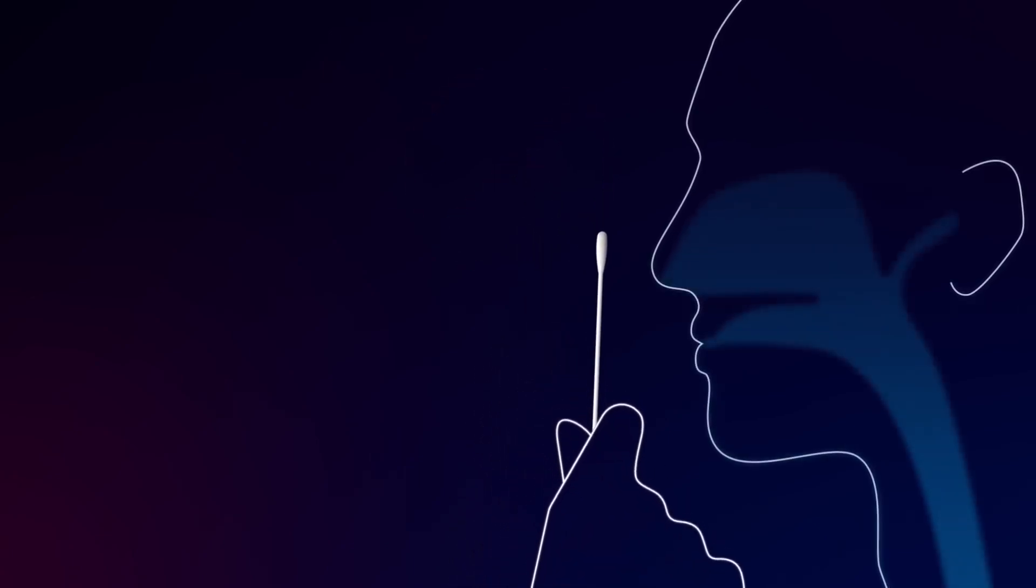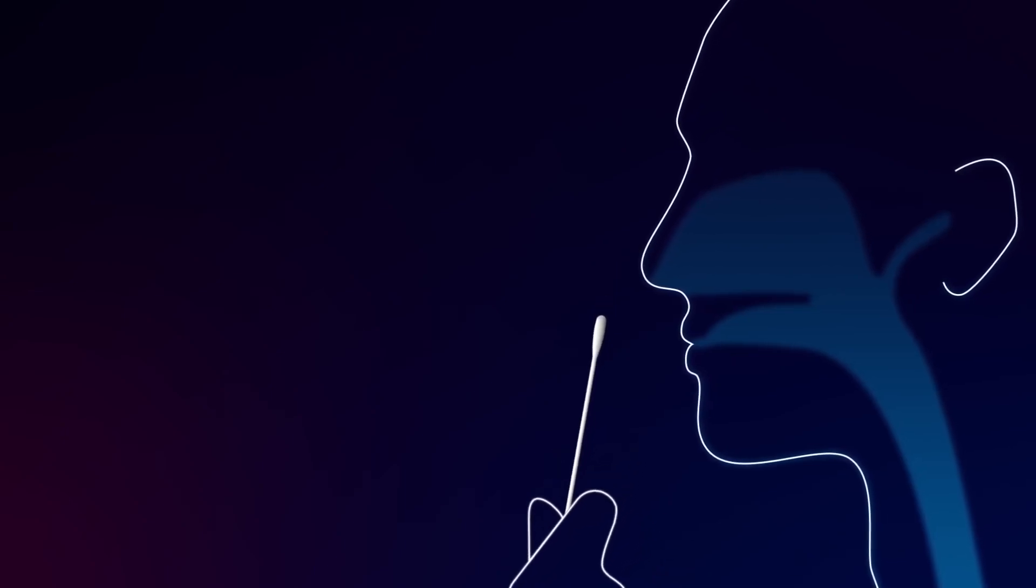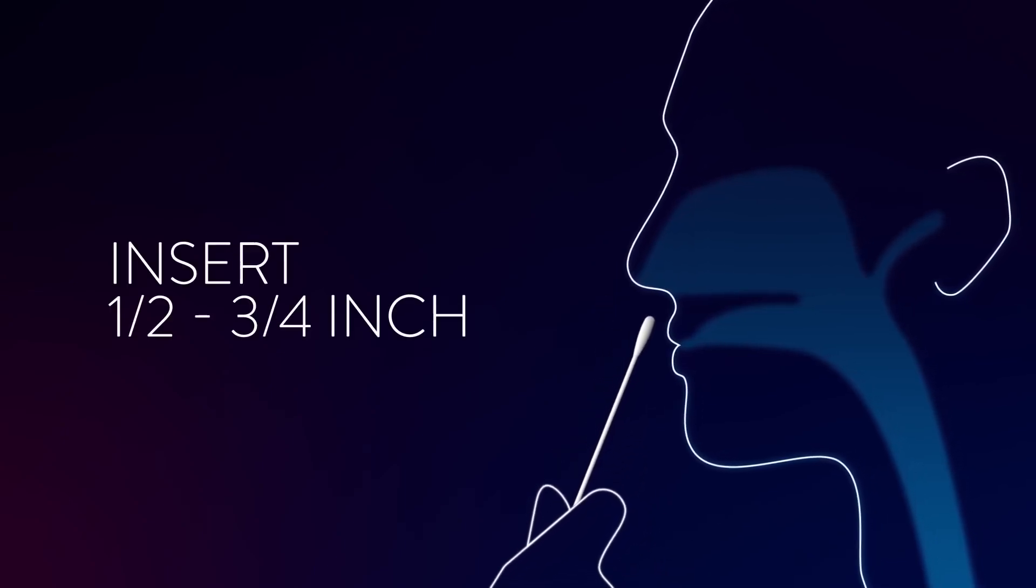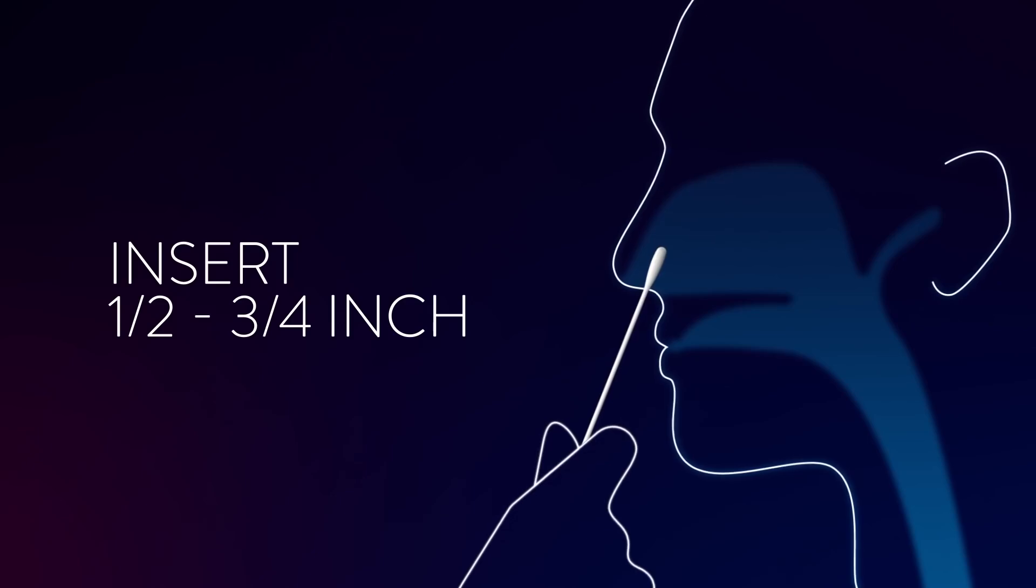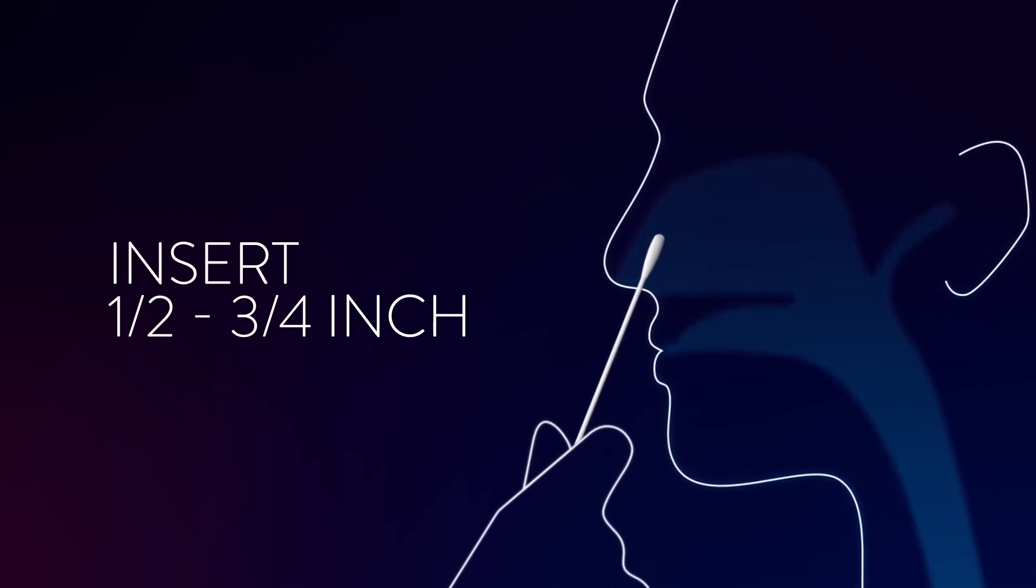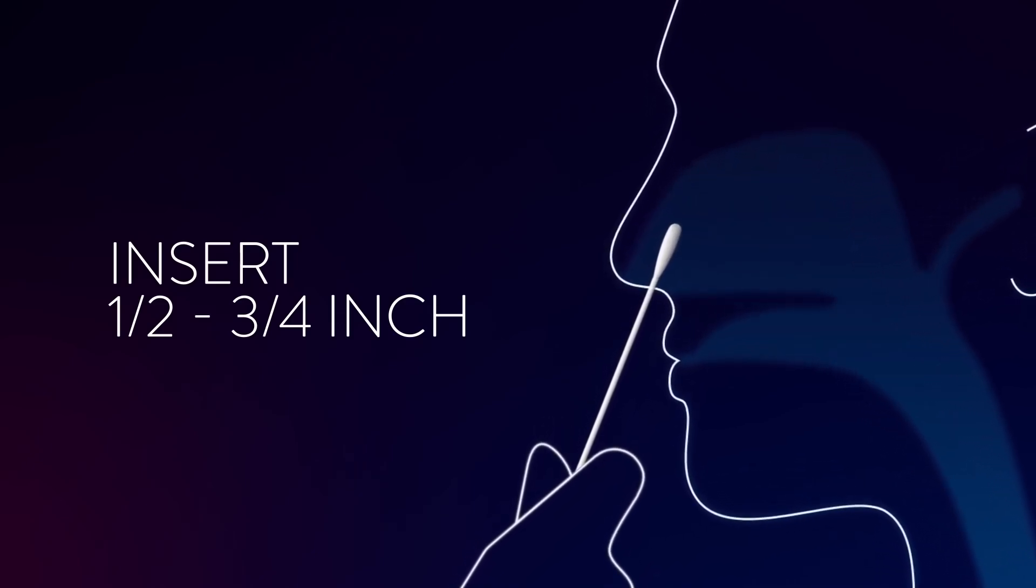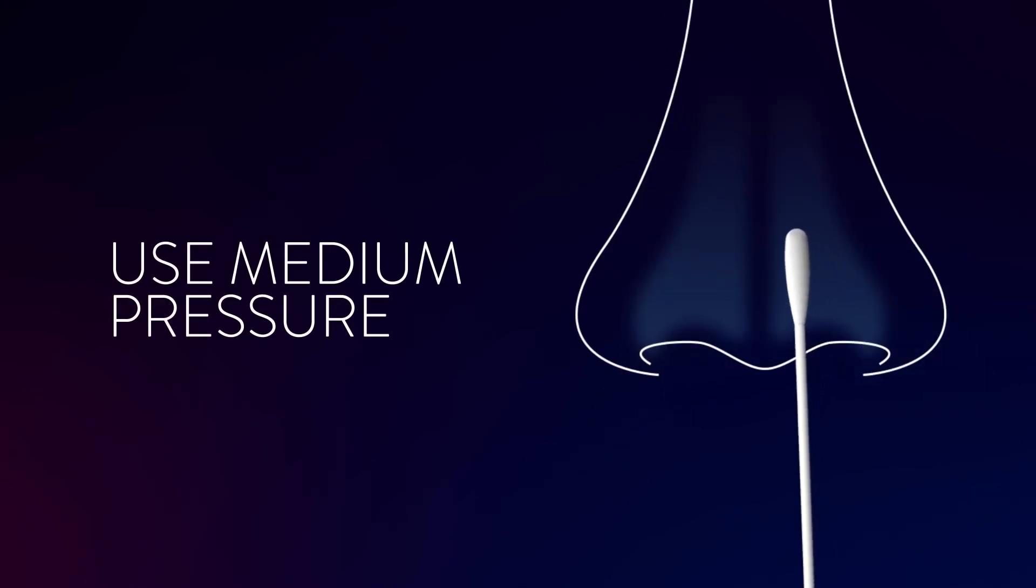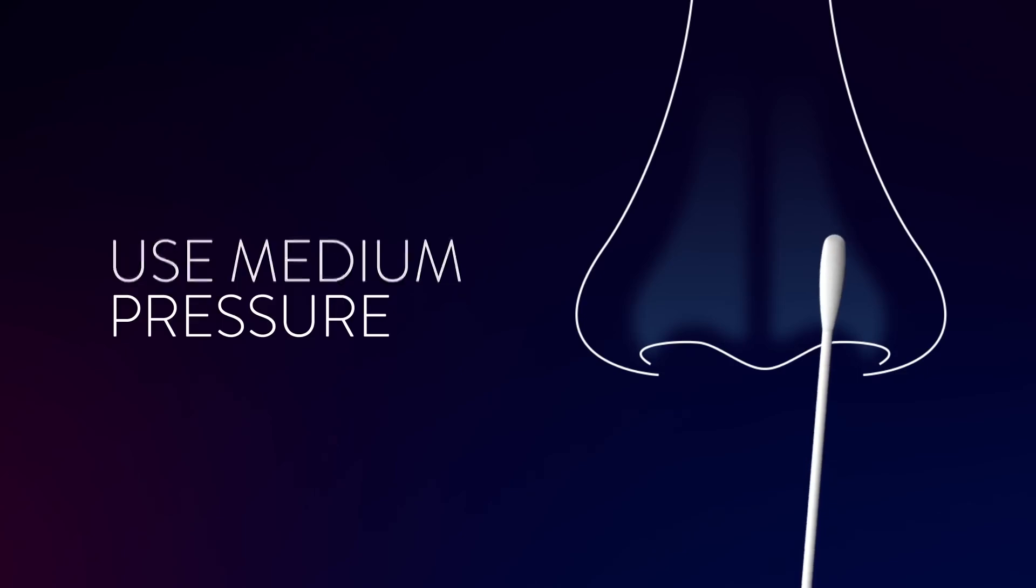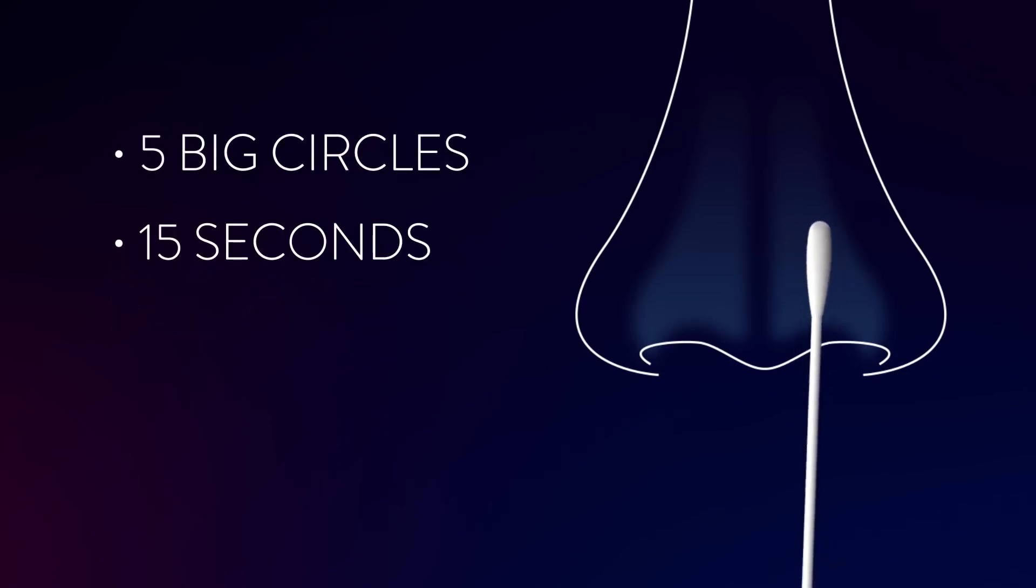Swab both nostrils carefully. Insert the entire soft tip of the swab into one nostril, usually one-half to three-quarter of an inch. You do not need to go deeper. Using medium pressure, rub the swab against all of the inside walls of your nostril. Make five big circles for about 15 seconds.